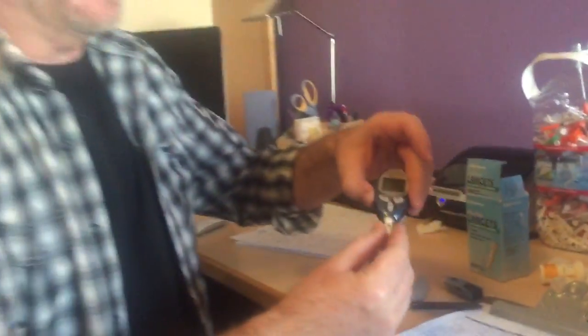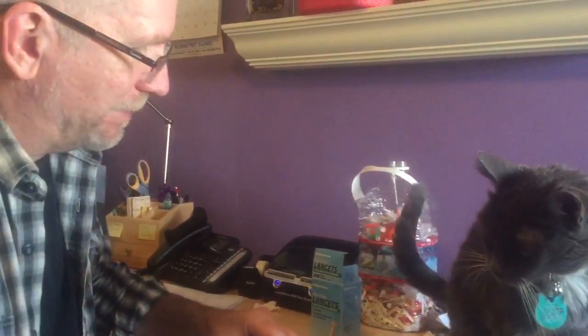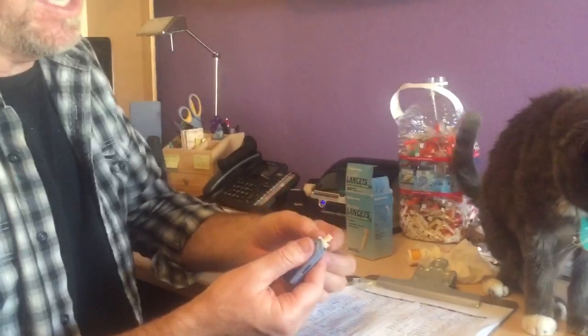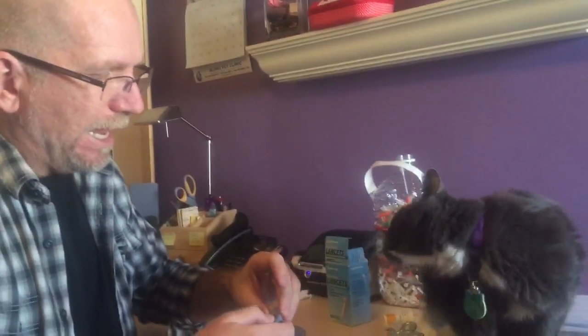When I'm done, I take this strip out and throw it into the disposable hazardous waste container. Then I take the lancet — this is where I always end up poking myself — pull that out and put it in there. Then we give him the shot or not the shot; right now he doesn't need one. Test him in the morning, then test him in the evening before bed. That's really it.